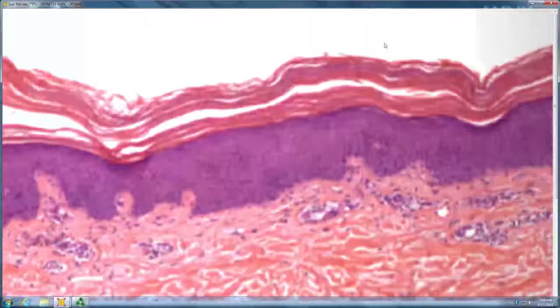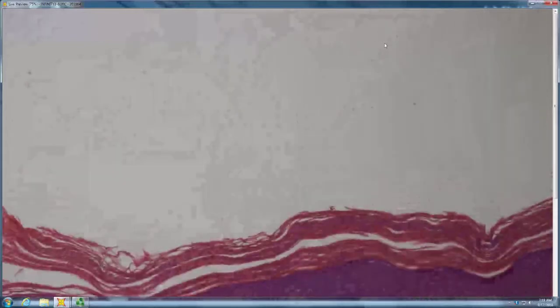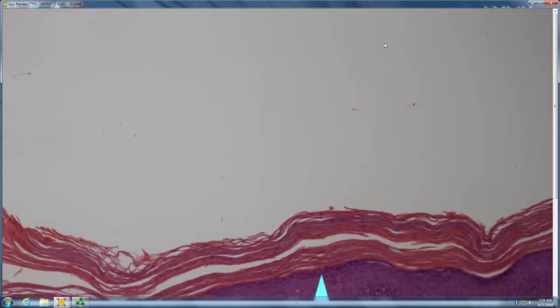I'm sorry, I thought I saw him using the horn from far away, but maybe it was just parakeratosis. And so that would be more of like a PRP with the alternating. So parakeratosis in sort of a checkerboard pattern. Do you have hyper or hypogranulosis? Hyper. And in psoriasis, you typically have the opposite. Yeah, hypo.